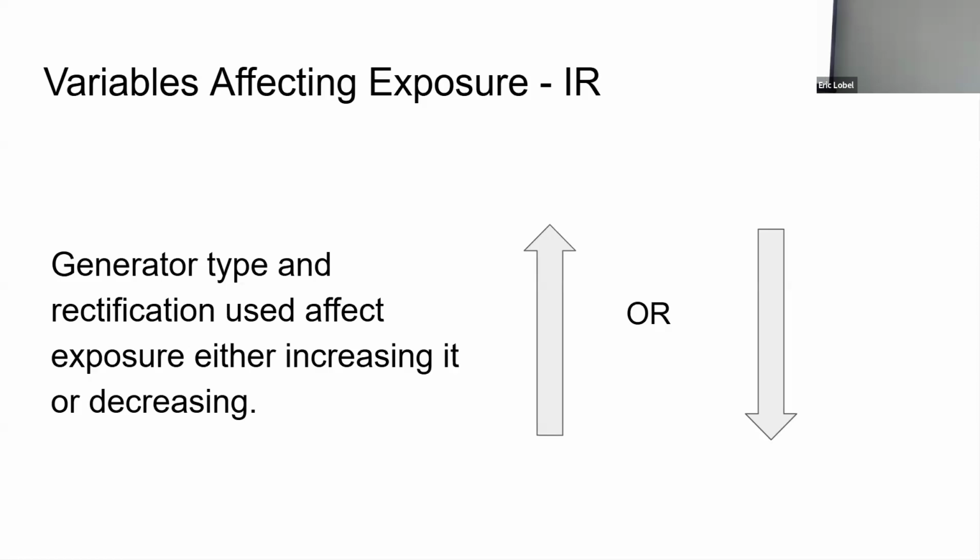So you see this in clinic now. When you get those colors that come out, like it's yellow, or it's green, or it's red, right? There's also a number probably nearby, right? And there's a scale, it's like from -3 up to +3. 0 in the middle is like just right. If you go into the positive numbers, you've used too much exposure. If you've gone into the negative numbers, you've used the opposite, not enough exposure. It's the not enough exposure that you worry about more because it shows up as graininess.